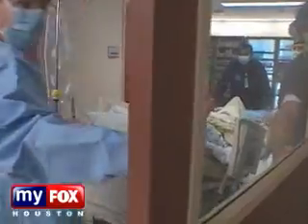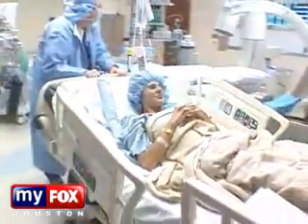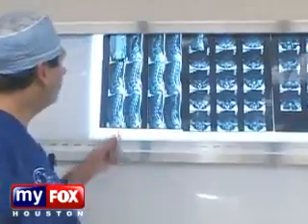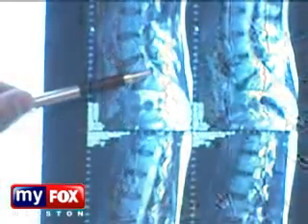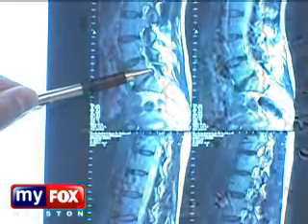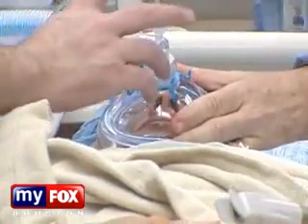We're going to be showing a case today of a middle-aged female with chronic low back pain and we're going to be doing some minimally invasive spine surgery. I have the MRIs here. You can see these are the lumbar discs on the MRI, and here at the lowest disc you can see there's really a great deal of height loss. There's also a small herniation here in the canal. Dr. Saqib Siddiqui will perform a minimally invasive lumbar spine fusion.